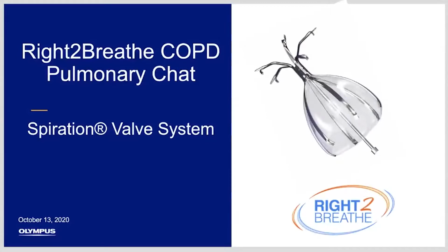This is obviously a topic that is very personal and something I'm very passionate about, and I'm really excited that we have partnered for this meeting, as well as the second Tuesday in November, to discuss things about the Spiration valve system. I'll let Dr. Hogarth talk a little bit more about it, but you can see in the picture it's just this small little umbrella-shaped one-way valve that gets placed inside the airways of a diseased lung.